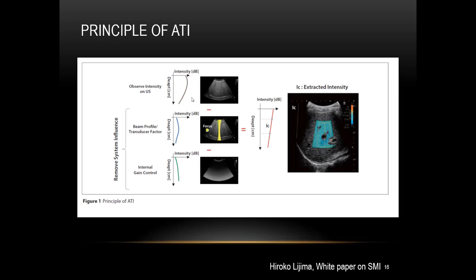So in order to measure a constant that shows the property of attenuation, presuming that the more fatty the liver, the attenuation coefficient will increase with the severity of the fatty liver, the machine has to adjust other factors, including focus, the beam homogeneity, and the gain compensation.